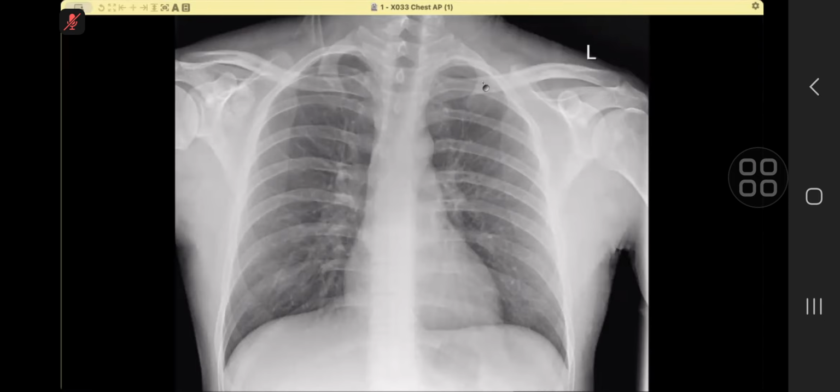CT for that? No. I will suggest further. I will like to rule out other metabolic disease, and I will also like to see other joints. And if this is the single abnormality, it could be synovial osteochondromatosis, for which I would suggest MRI of the right shoulder joint for further characterization. What can you do now to evaluate it further? The patient is in A&E. I would like to see the orthogonal view of the right shoulder joint.